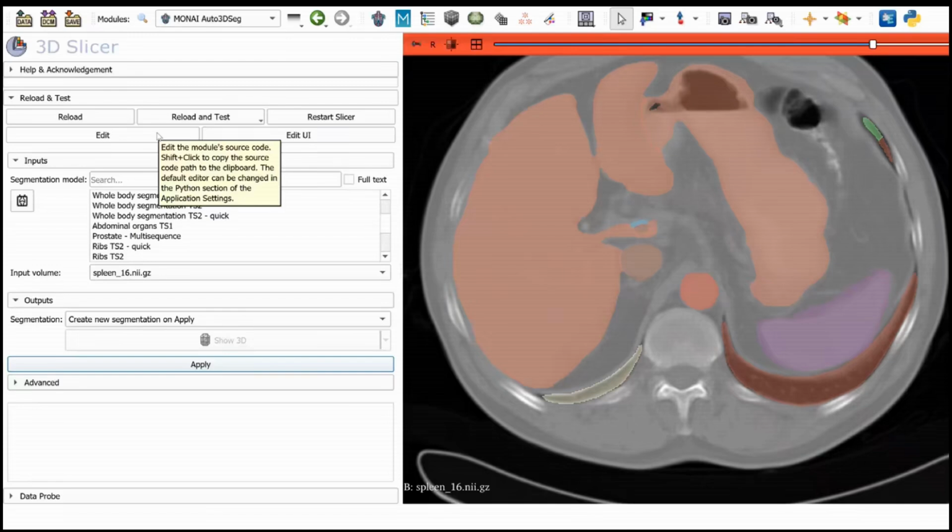And you can also consume those models in MONAI Label. That basically makes it rounded. But yeah, that's the thing that I wanted to show you. I don't know if you have questions or comments.